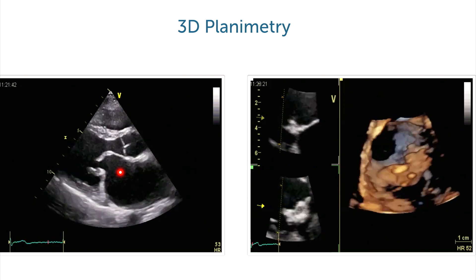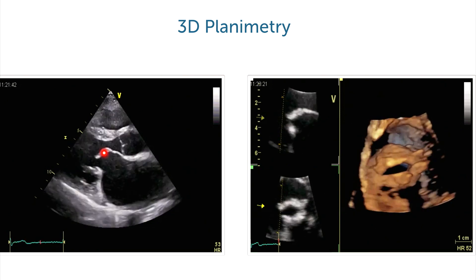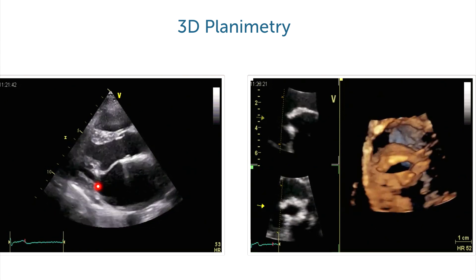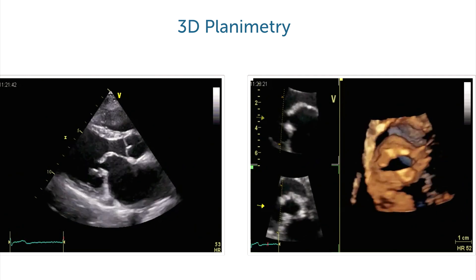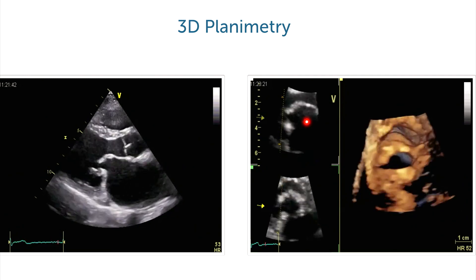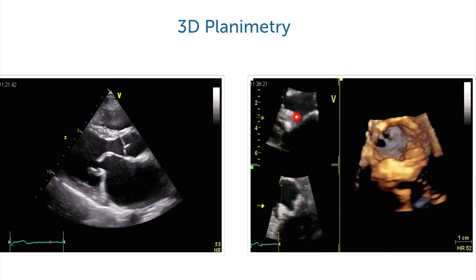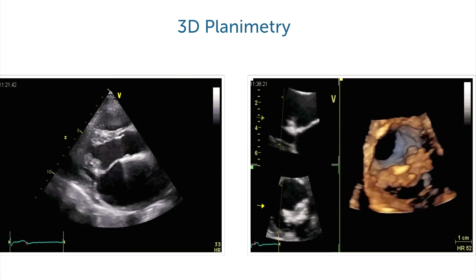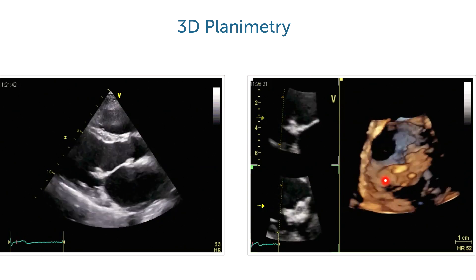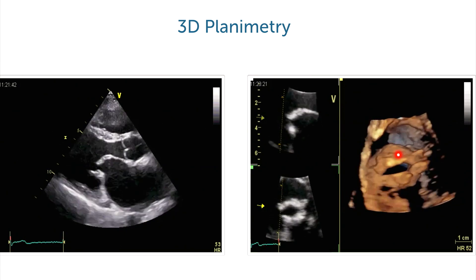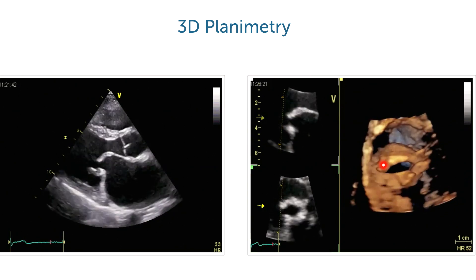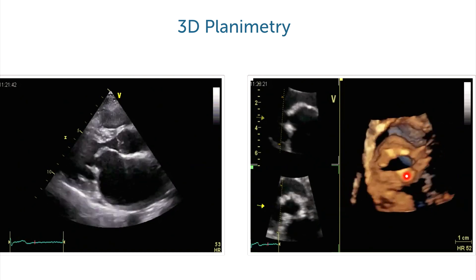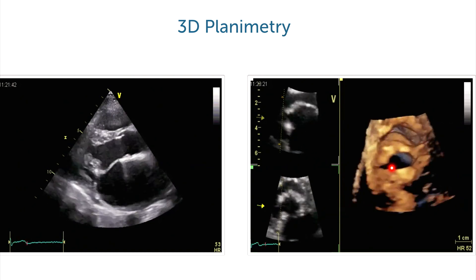Here is an example of how this is done. This is the original image in 2D, and then we perform 3D echocardiography and are able to align the image plane so that we get a 3D reconstruction, which looks like this. Then we can perform measurements where we are truly within the smallest orifice.